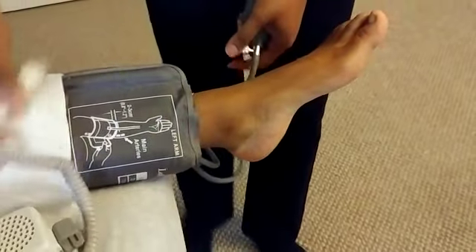So in this case, you have a brachial pressure of 130 and the highest ankle pressure of 150. So you divide 150 by the highest brachial pressure, which in her case was 130, and you will have an ankle-brachial index of greater than 1, which in her case is a normal result. When you have an ABI of 0.9 or less, that is abnormal.